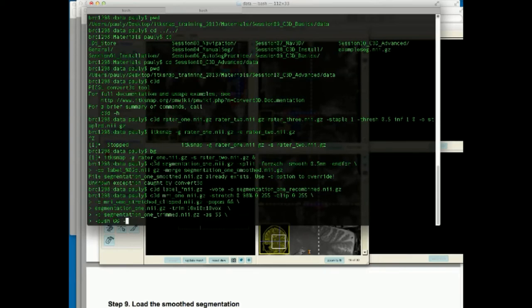First, in this case they're all in the same space, so we don't need to really change any numbers. We don't need any linear interpolation or anything like that. So we are going to say interpolation type is nearest neighbor, and notice that I just said int here. Phil showed you interpolation. A lot of the C3D commands have useful shortcuts. This is an example of that.